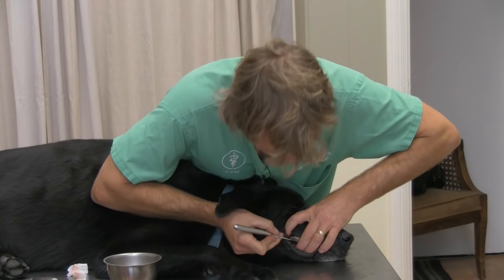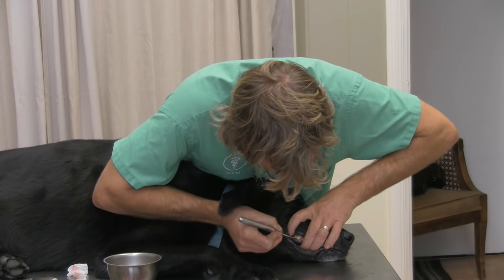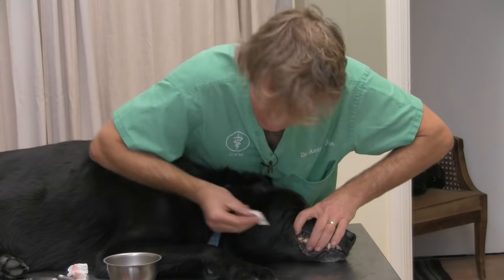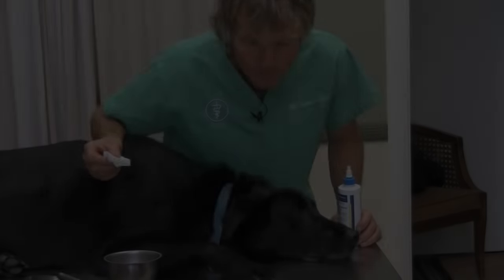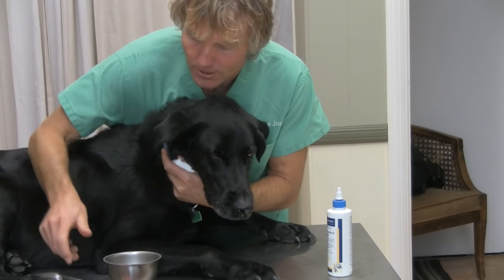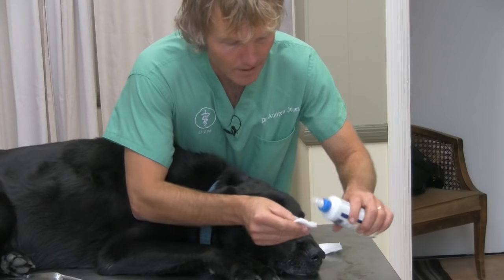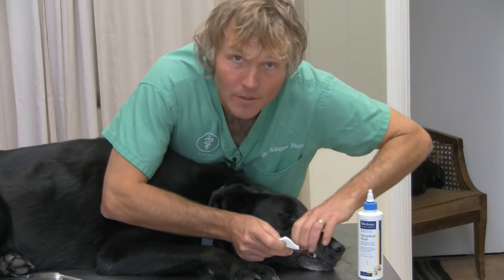You actually feel it when the tooth is smooth and you're scraping — all of a sudden you can feel this nice clean scrape and there's nothing abrasive, so then you've gotten rid of the tartar that was present. After that I'll use a gauze soaked in a little bit of water to wipe that tooth. Then, especially for thoroughness, you can finish up with some type of antiseptic rinse. We're just trying to minimize the inflammation that's happening on those gums, being especially thorough and getting rid of as much bacteria as possible.